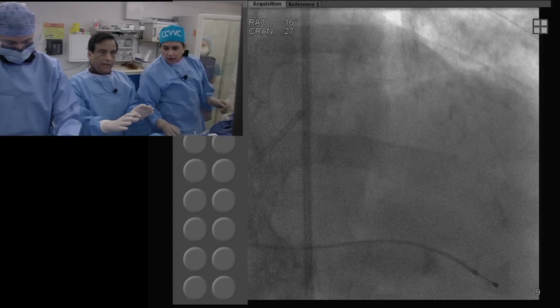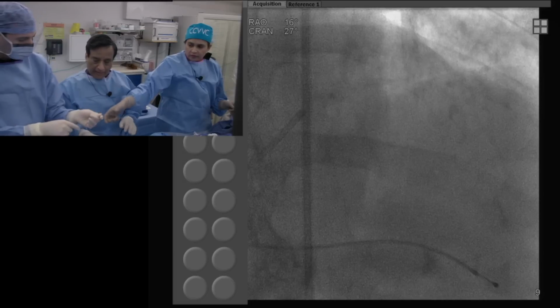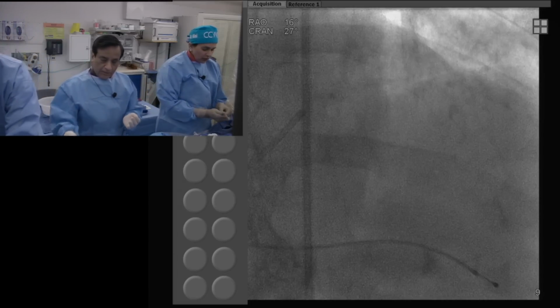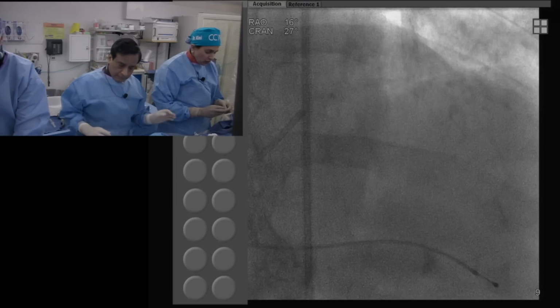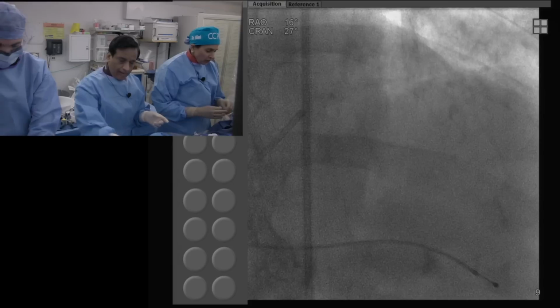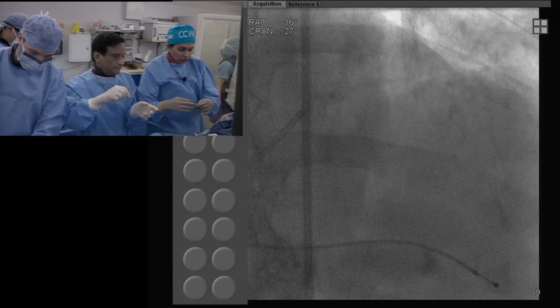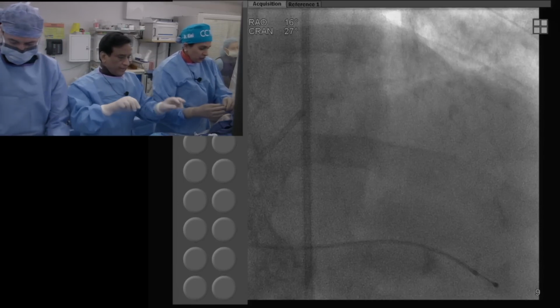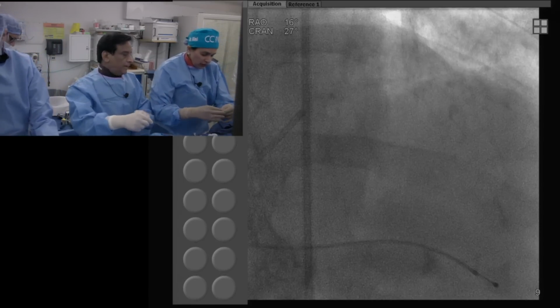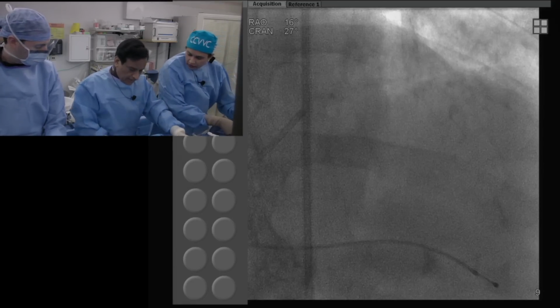So this patient, not by the Protect 2 guideline, but will qualify otherwise. Then the question is, do you need it? They have not truly defined complex PCI. Definitely unprotected left main, rotational atherectomy, bifurcation intervention, then CTO. Even if it's normal EF, you have 3 vessel disease. So it's definitely justified.